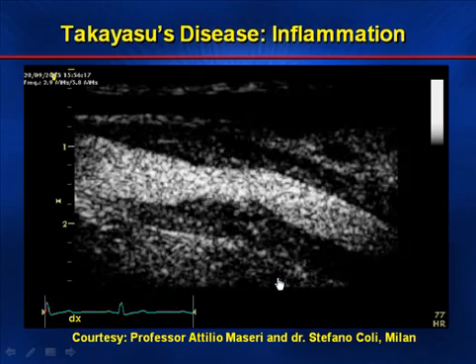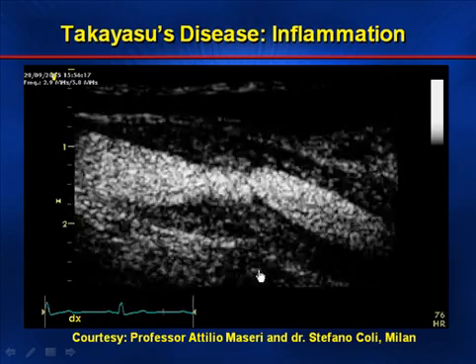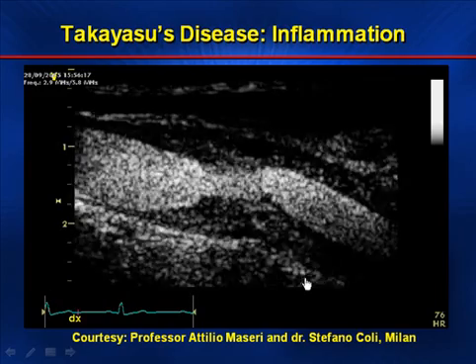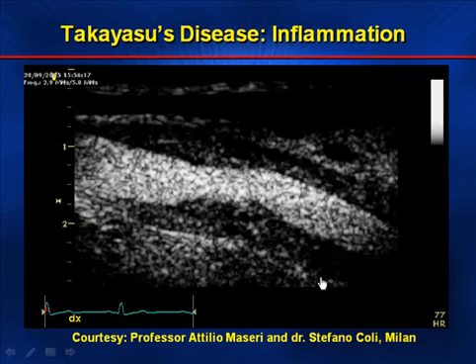injected through a peripheral vein in the arm, circulating through the right heart, lungs, ultimately to the left heart, and then to the carotid artery. So none of these are arterial injections, but venous injections requiring only a ½ milliliter of a contrast agent.